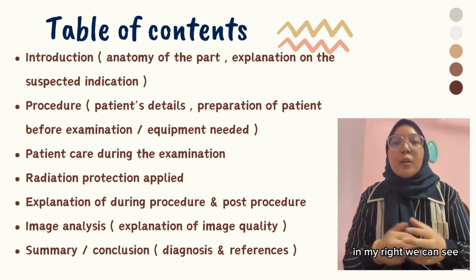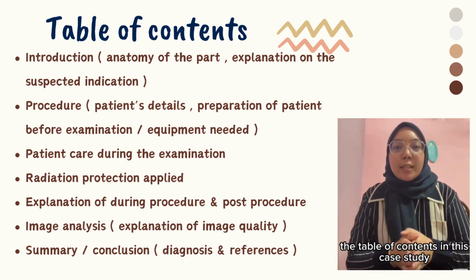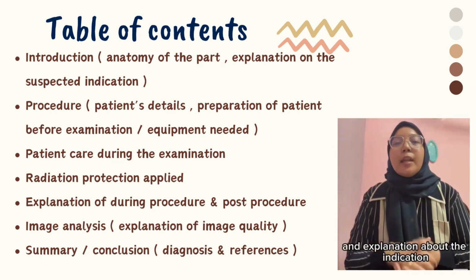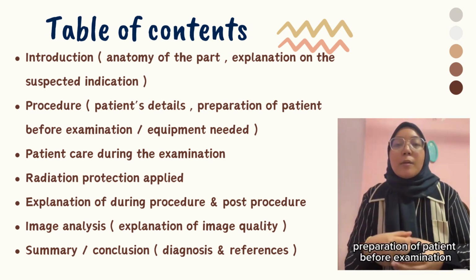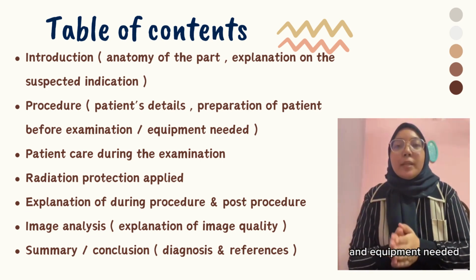On my right, we can see the table of contents in this case study. First, I have the introduction, which is anatomy of the part and explanation about the indication. Second, I have the procedure, which includes patient's details, preparation of patient before examination and equipment needed.